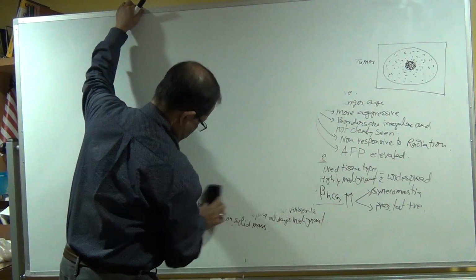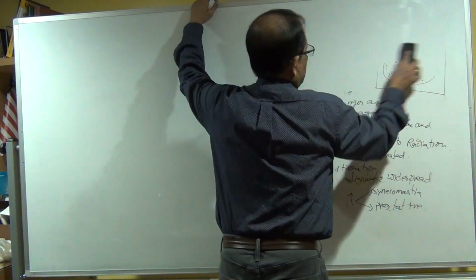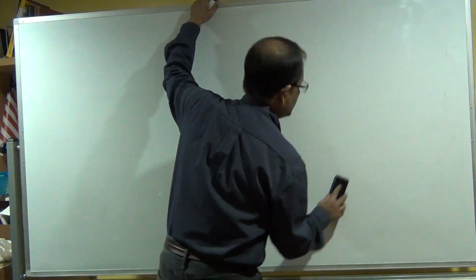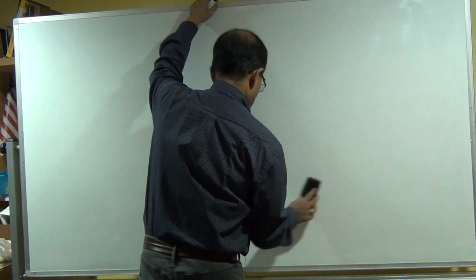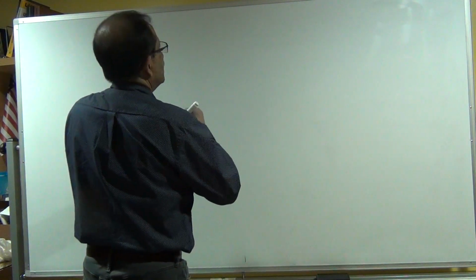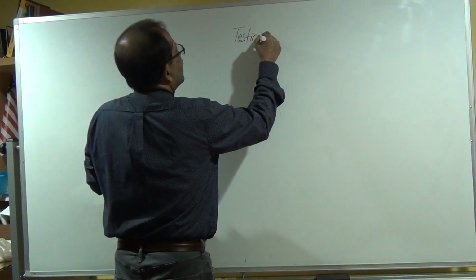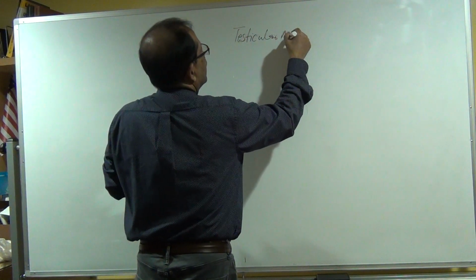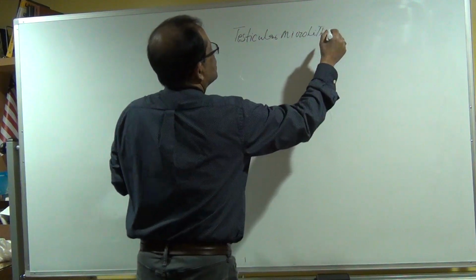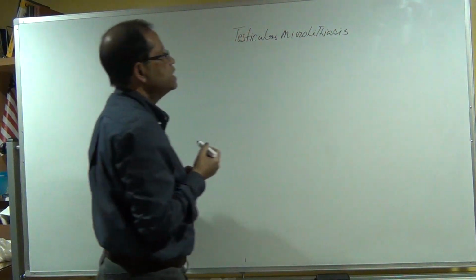I'm going to give you that diagram. Testicular microlithiasis.